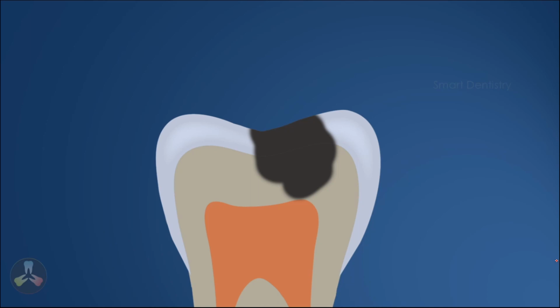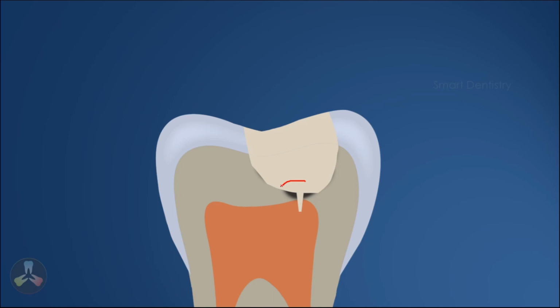There is a deep caries, and the first step before giving an intrapulpal anesthesia is to remove the caries as much as possible from the surfaces. Then we can use a needle burr or a thin tapered fissure burr to create a small punch inside the pulp.